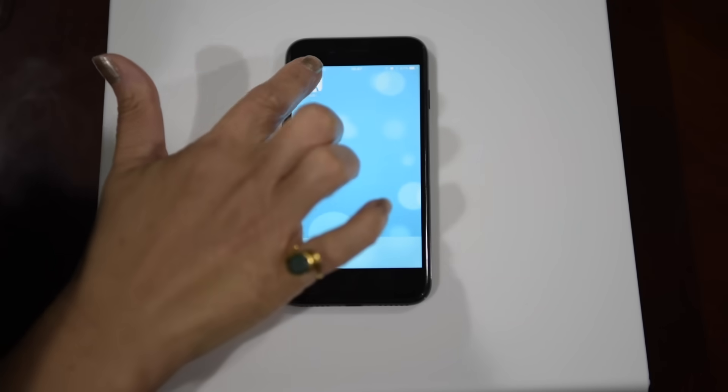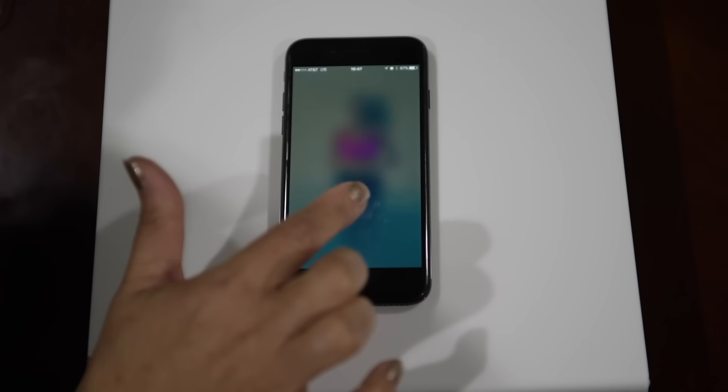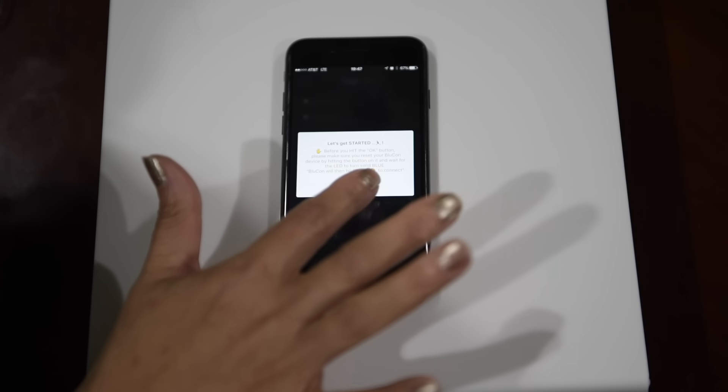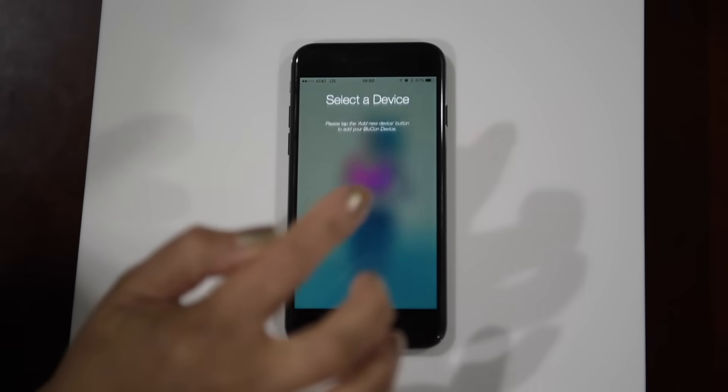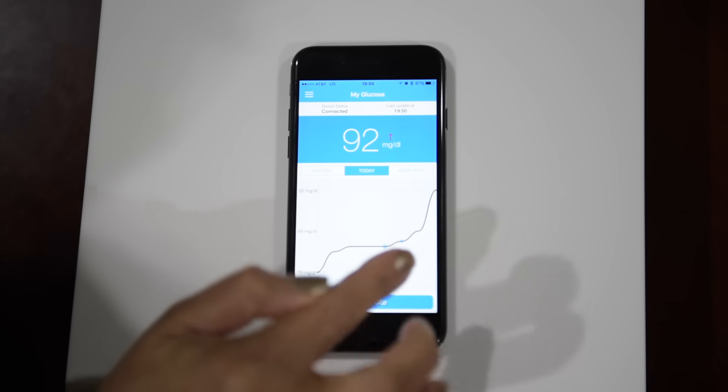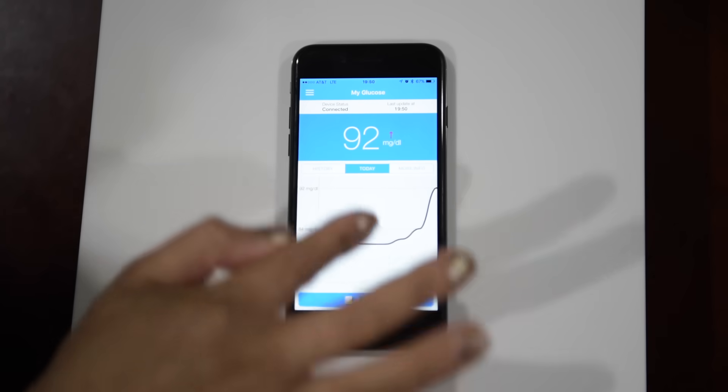Now launch the Bluecorn app by tapping on the app icon. If you want to share the reading with your doctor or caregivers you can register, otherwise you can just skip the registration part and it will start receiving the readings from the sensor.